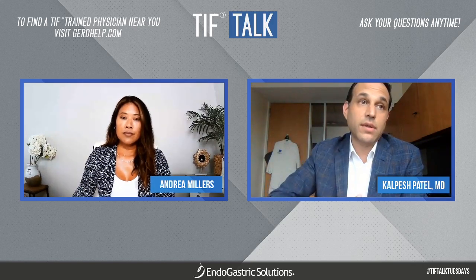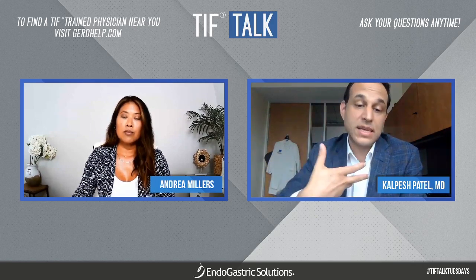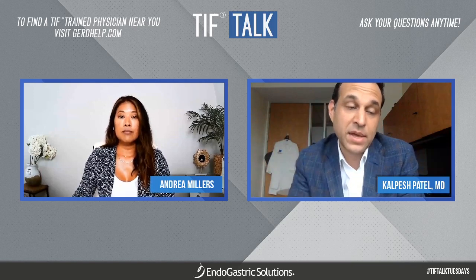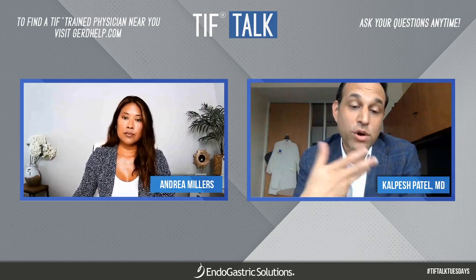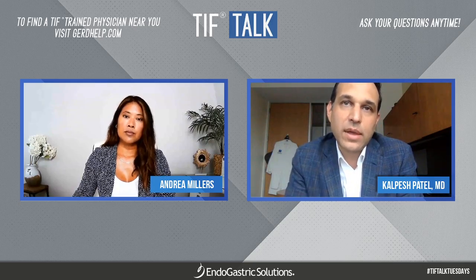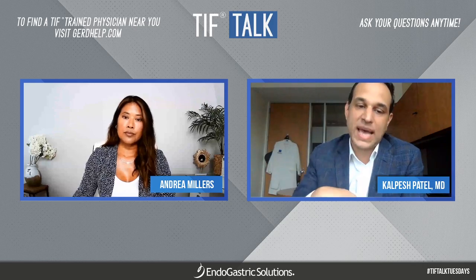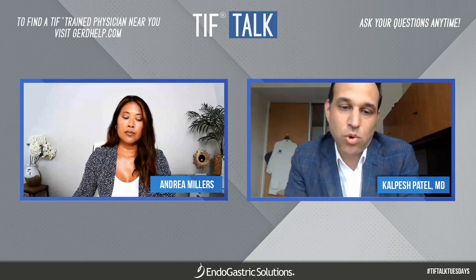And they record the level of acid and other reflux items into the esophagus anywhere from a 24 to 48 hour period of time. And during that time, you're able to eat and drink your regular way in order for us to see what really is going on. Because we certainly have a lot of respect for what a patient is feeling. We want to make sure that matches up with what's happening from a physiologic standpoint so we can choose the treatment accordingly.